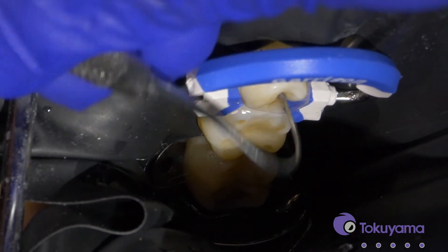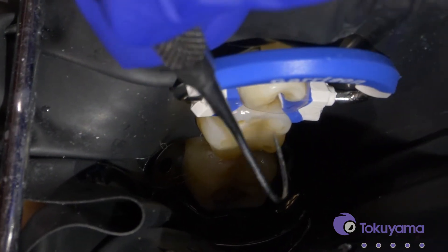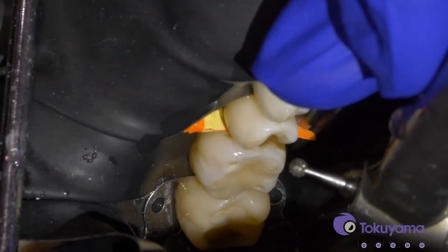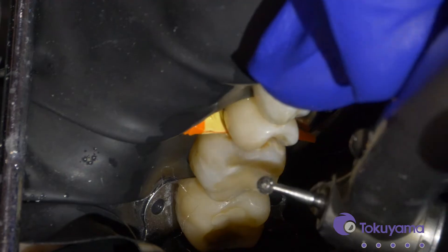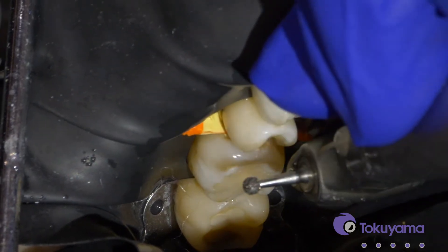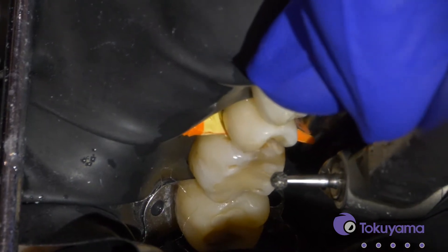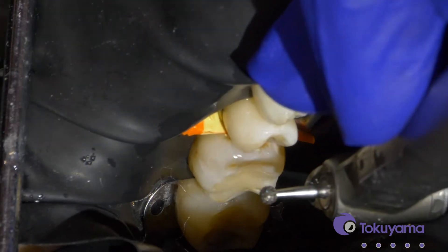That tooth is pretty much ready, and we do have that little bit of stain there that we'll block out with the Omni Chroma blocker flow. The last step before we start putting the restoration in is we're going to do a bevel around the cavity surface margin of the tooth. I like to use a round diamond like this one — that's going to help bond more predictably and also improve the color gradation and help blend the restoration to the tooth.